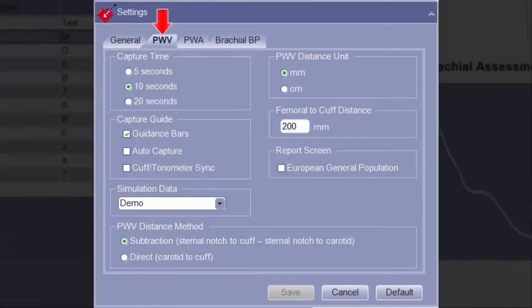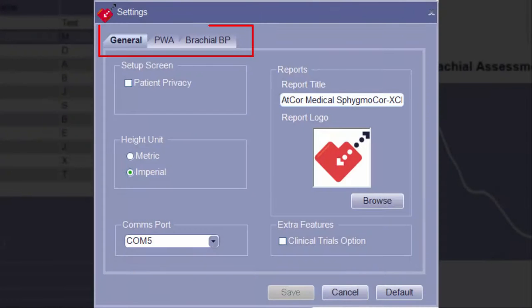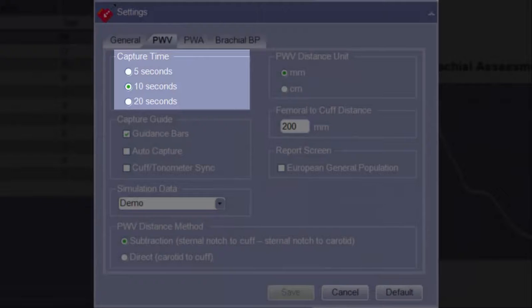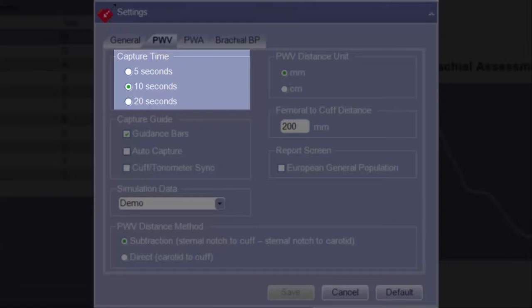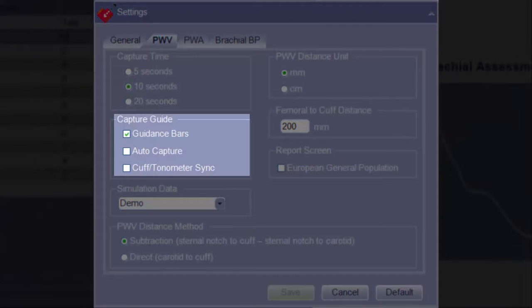The second tab of the Settings screen is the PWV tab. This tab has settings related to pulse wave velocity assessments. If the Spigma Core XL has not been configured to perform pulse wave velocity, this tab will not be present. The Capture Time option allows for the selection of the amount of time desired to capture waveform data during pulse wave velocity assessments. The default and most commonly used capture time is 10 seconds.